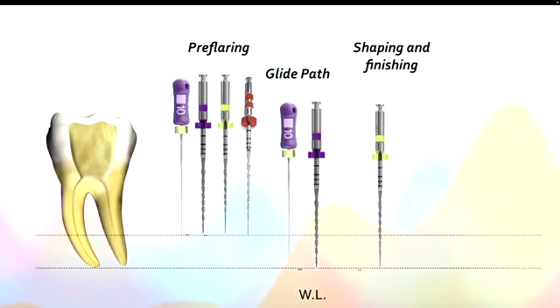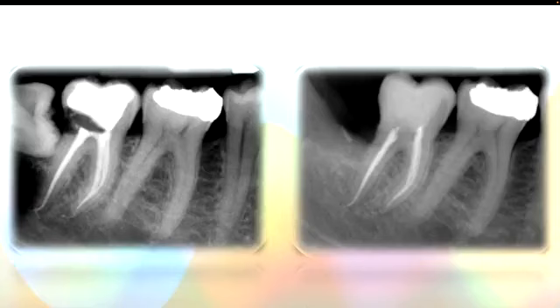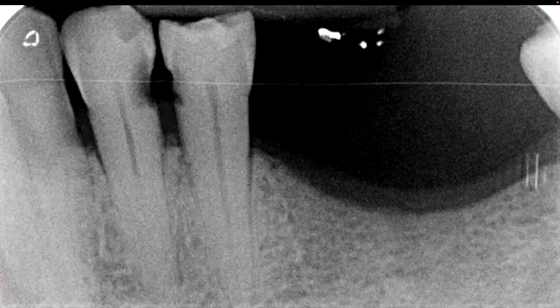In narrow and difficult cases, maybe you are not going to the 3504; we can stop at the 2004 or 2506. As in this case, for example, of a second lower molar, the patient had a pulpitis. I did the endodontic treatment, then before restoring, I asked to remove the wisdom tooth that was in a difficult position for me to do the restoration properly, and I did the restoration. No problems. In this case, I finished with 20 in the mesials and 25 in the distal.